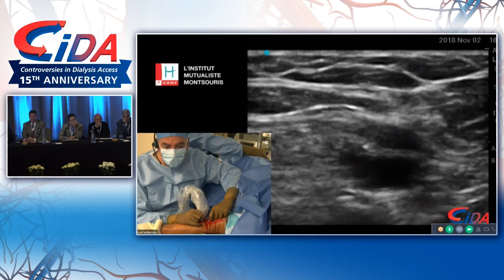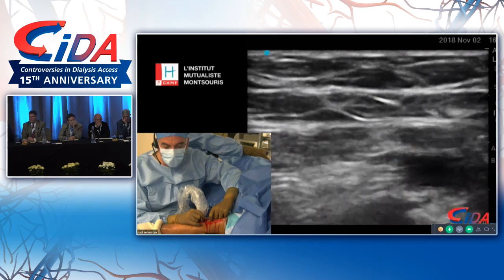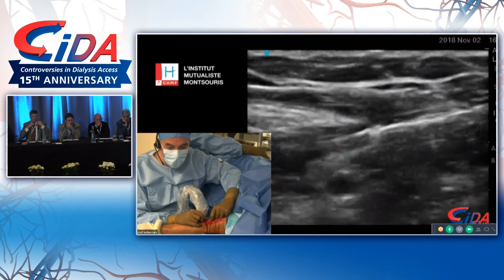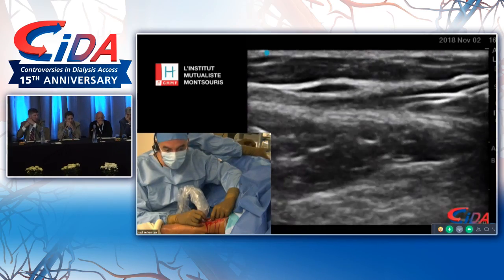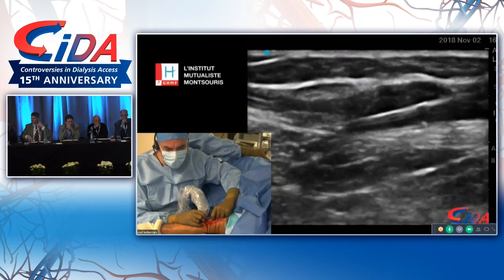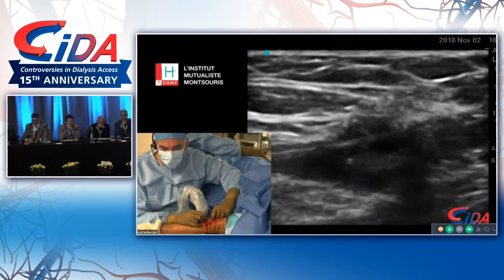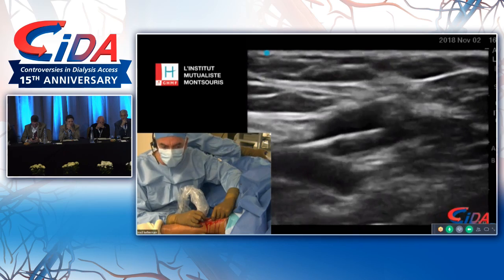You see the artery coming in here. You see the artery that is meeting the balloon. So I know that I'm inflating well the anastomosis and the perforator. So I'm going to pull the balloon back with the sheath all together, and I'm going to inflate the perforator a bit higher. Go. And now I'm inflating the whole length of the perforator. You see that we were successful in creating a water-tight seal anastomosis because we have the balloon inflating the perforator. There is no hematoma or anything else created around the artery. So this means that we have a good and solid anastomosis.